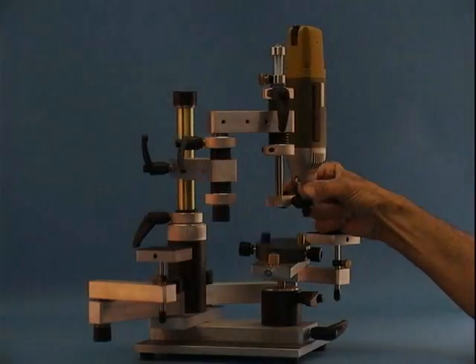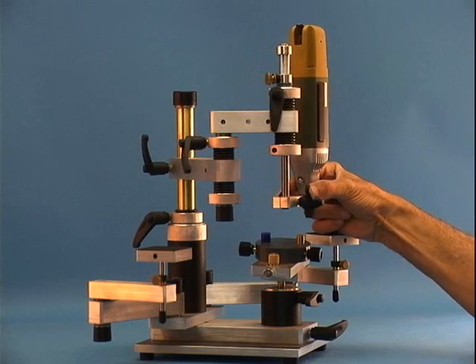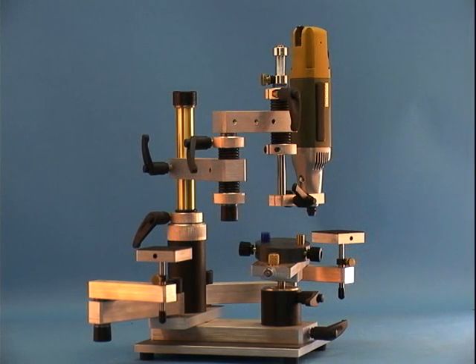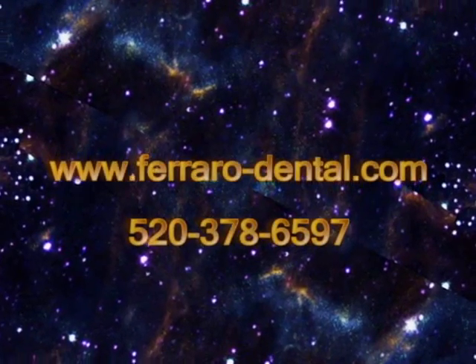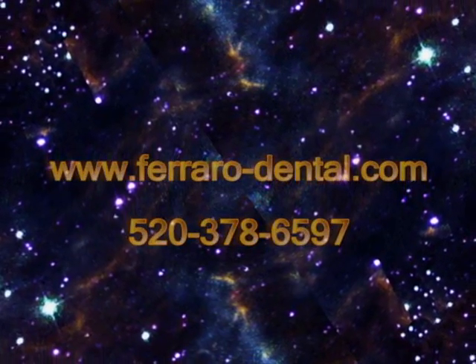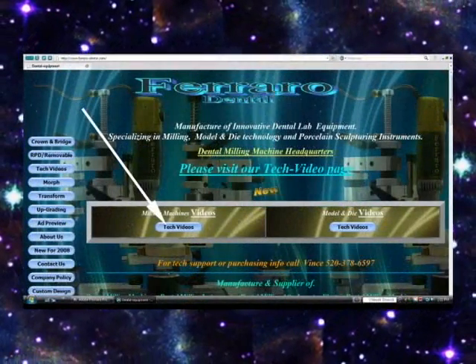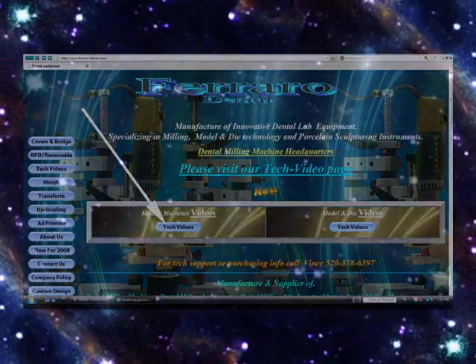Take special notice to the secondary or the middle arm. Now it adds to the fluid movement of the motor arm. This triple jointed arm is what makes our milling machines so unique.